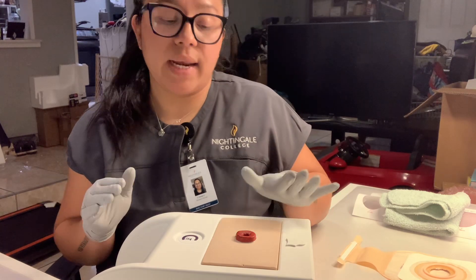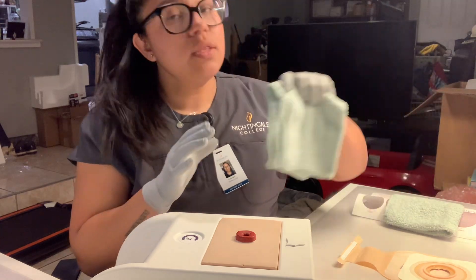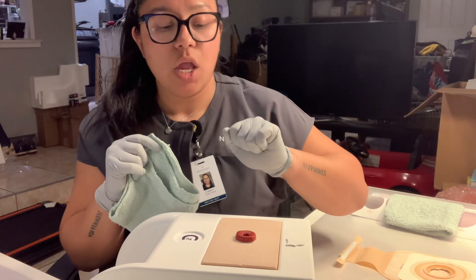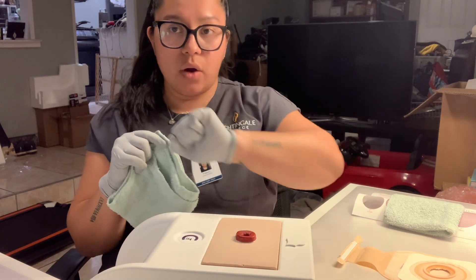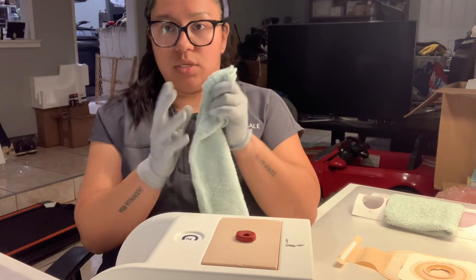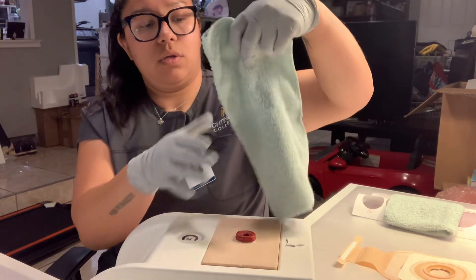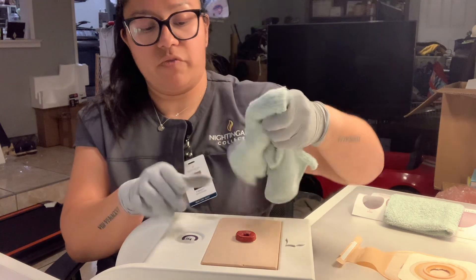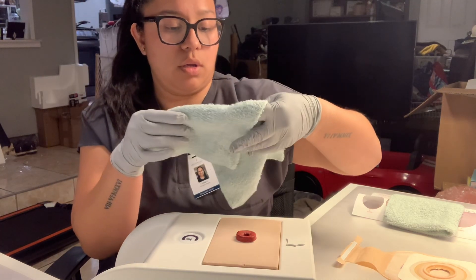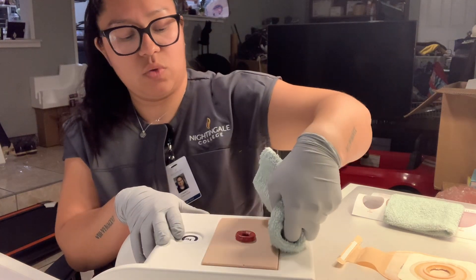From here we're going to go ahead and clean the area with a washcloth with warm water. Using the washcloth, we want to use a different corner every time we clean the area. We want to do the motion of going inner to outer, and every time we do the motion we're going to use a different corner. So we'll go inner to outer, then use a different corner, inner to outer, and one more time, inner to outer.